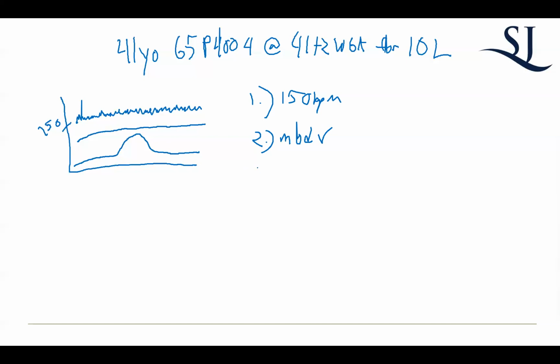So now what's the next thing to assess the fetal heart rate tracing? Do you check for accelerations or decelerations? Yep, accelerations and decelerations. Now, we don't have any accels, which is okay. And we don't have any decels, which is actually more of what we want to see. Then fourth, you look at contractions. So she has one contraction. So overall, this is okay.